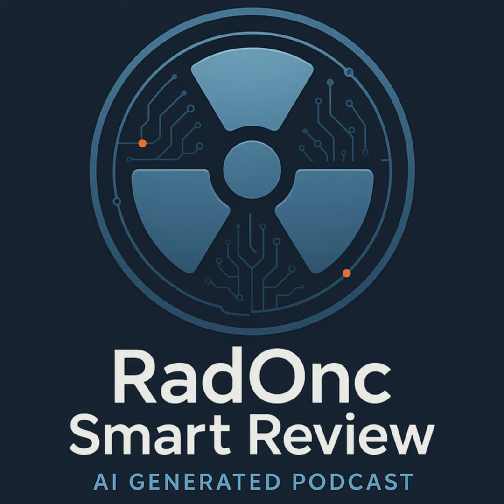Got it. Any others? The other big one is Doppler ultrasound. This uses the Doppler effect to detect motion, primarily blood flow. The Doppler effect, like the pitch change from an ambulance siren. Exactly the same principle. If the sound waves reflect off something moving towards the transducer, like red blood cells, the returning echo has a slightly higher frequency. If they reflect off something moving away, the echo has a slightly lower frequency. And the machine can detect this tiny frequency shift. Yes. And the magnitude of the frequency shift tells you how fast the blood is moving. And the sign of the shift, higher or lower, tells you the direction relative to the transducer.